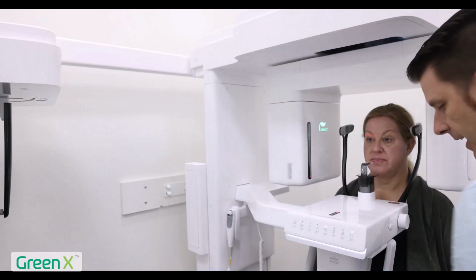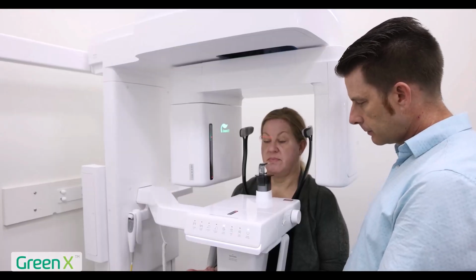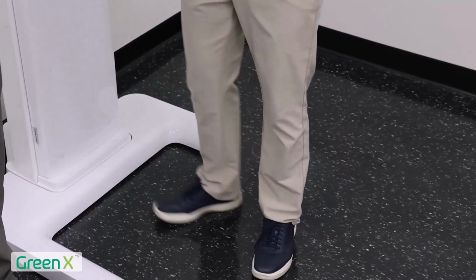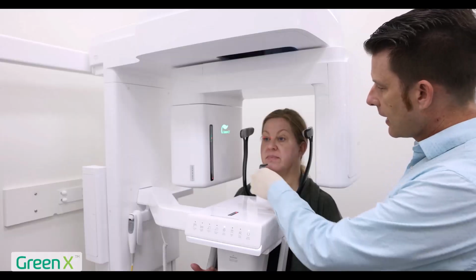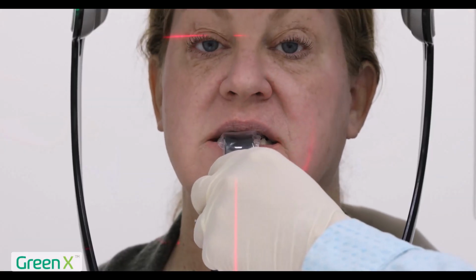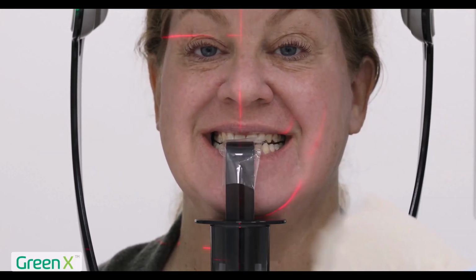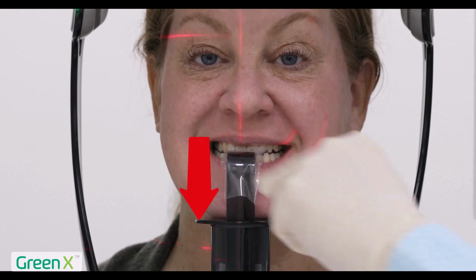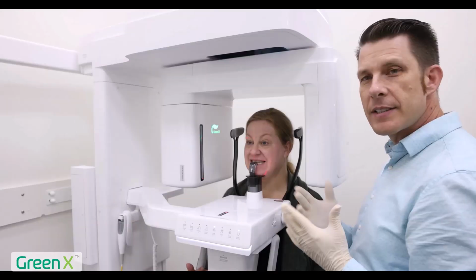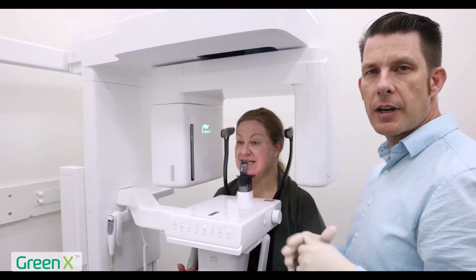I'm going to have my patient hold on the hand rest with their palms facing up. Walk forward and have your feet shoulder length apart. At this point, I'm going to have the patient open and move forward and bite on the bite stick. Smile really big for me. I can see that the patient's in the bite stick groove. And I want to gently push on the bite stick to ensure the patient's chin is firm on the chin rest.